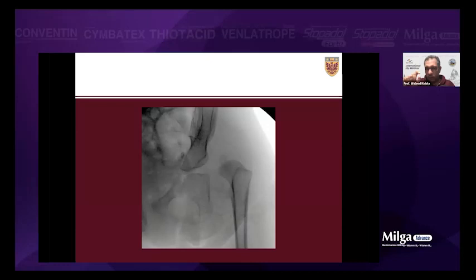So you find the tendon. I use peanuts to find the tendon, both medial and lateral, and you expose it nicely, and you suture it. I put a stay suture in the distal and the proximal side, because sometimes I lose the proximal when I do the correction. So it's easy for me to find it, or sometimes I tie both of them together at the end. Then when you hold it with the sutures, you start to peel it off from underneath using the peanuts.